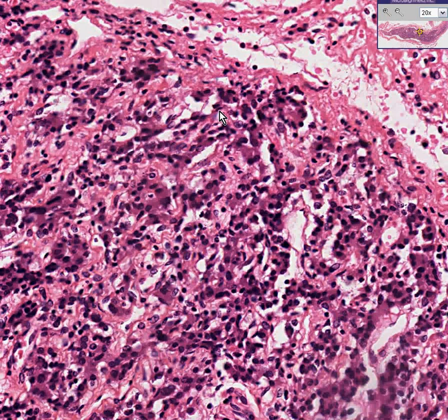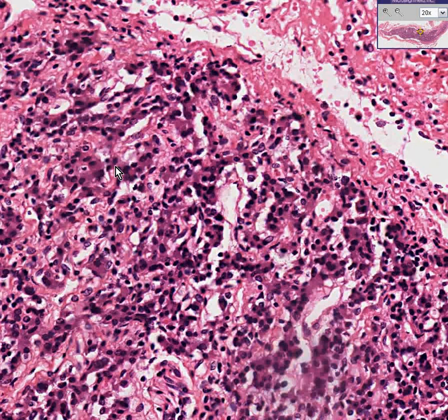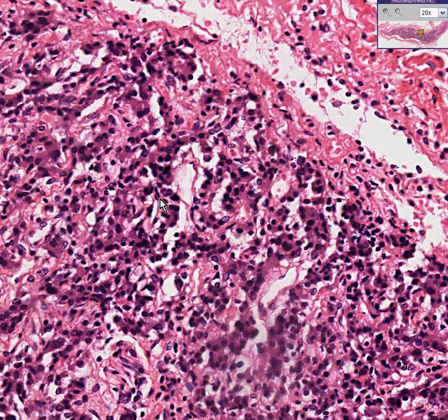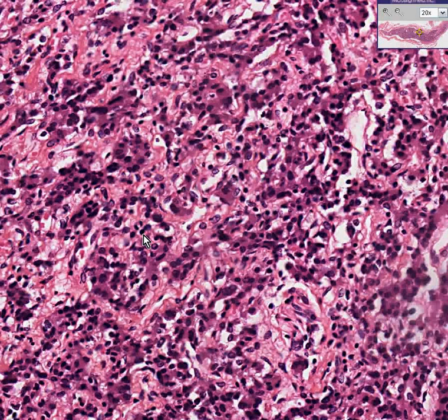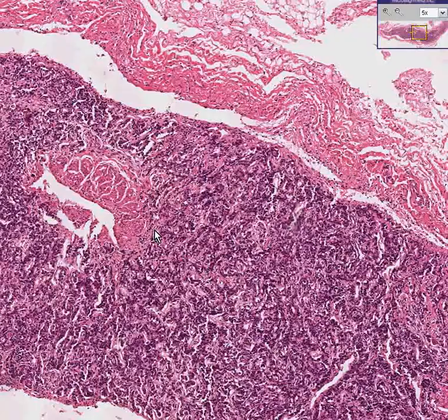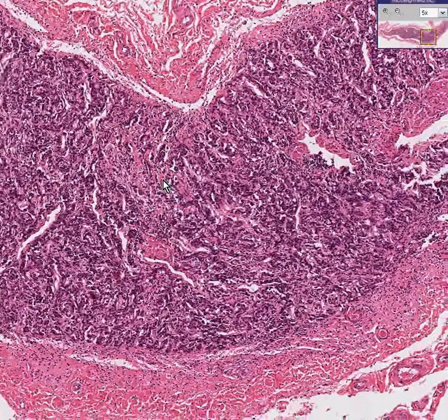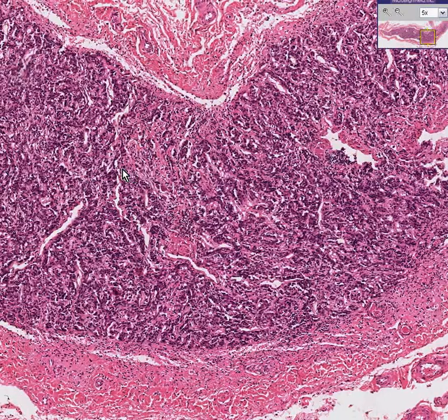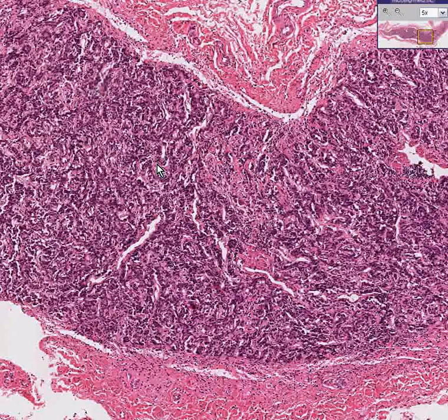In Addison's disease, the adrenal cortex acts as foreign antigens. In other words, like every other autoimmune disease, there are substances here in the cortex which evoke an immune response by the body's own antibodies, and therefore an inflammatory response as well. And perhaps that's the reason why you really have a hard time recognizing this structure as being adrenal cortex. This is primary chronic adrenal insufficiency, or if you would prefer the term, autoimmune adrenal cortex-itis. Thank you very much.